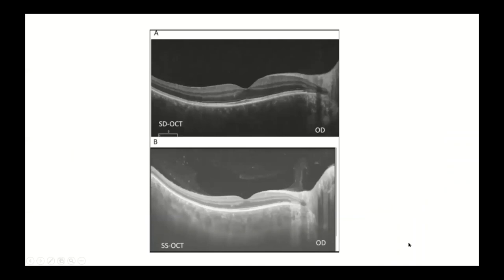Here are two pictures comparing a standard spectral domain OCT scan and a swept source OCT scan. The spectral domain image is still beautiful — you can see the foveal pit and multiple retinal layers. In the swept source image below, you can see even more detail: what appears as a smoky appearance represents the collagen fibers of the vitreous, and the dark areas — what some call the bursa premacularis — are visible here.